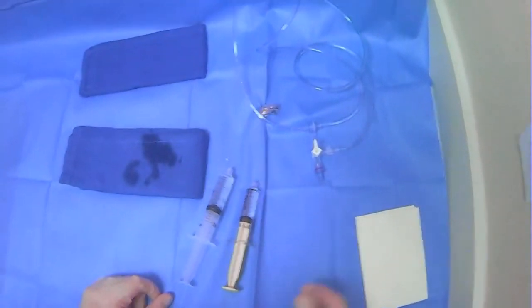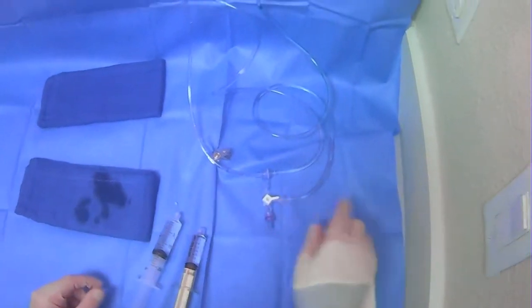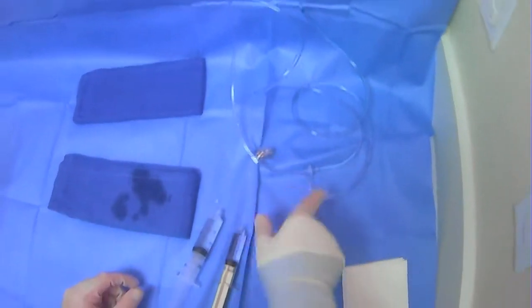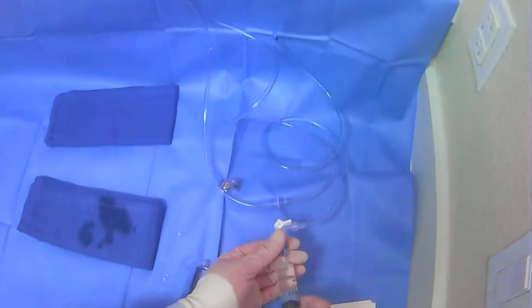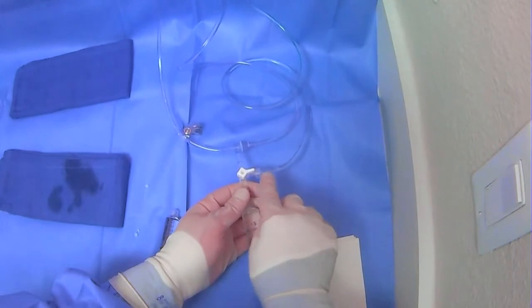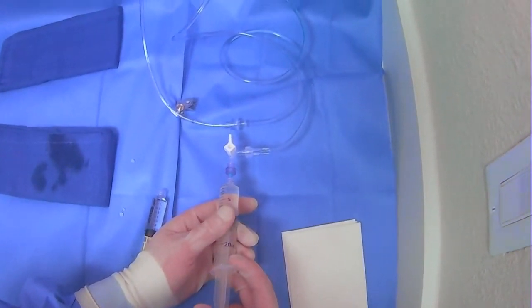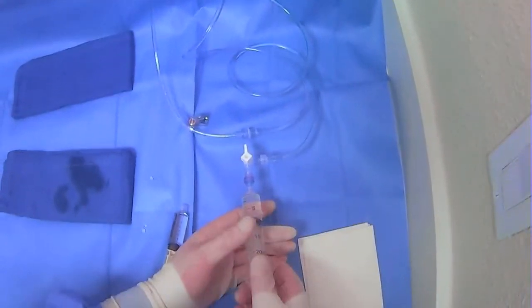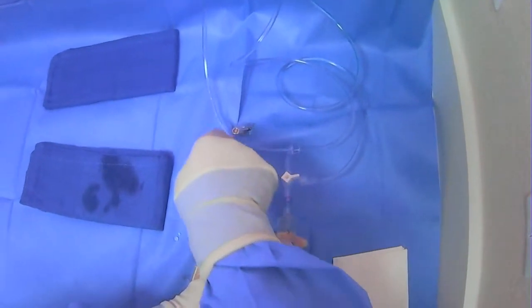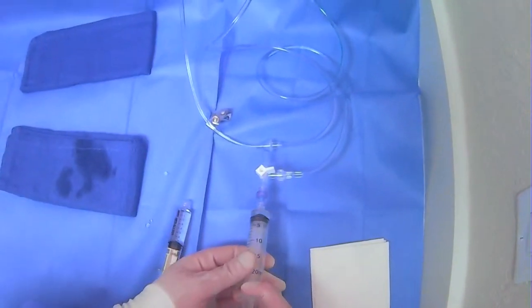You'll have multiple syringes of each kind and you'll want to fill them up at the beginning of the case. It's always good to close off the contrast port since you'll often be using saline and waste. If the stopcock is not closed to the contrast line and you flush, the saline will actually go back through that line and contaminate your contrast. So always make sure it's in the correct orientation — it's a one-way valve that routes fluid down to the waste bag.